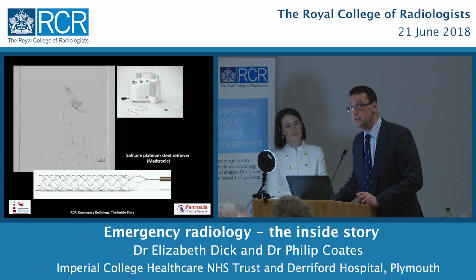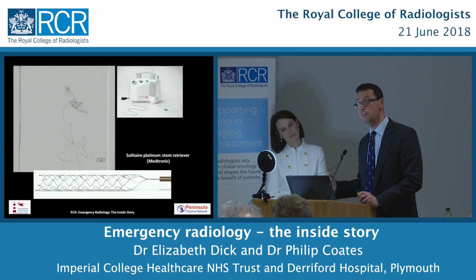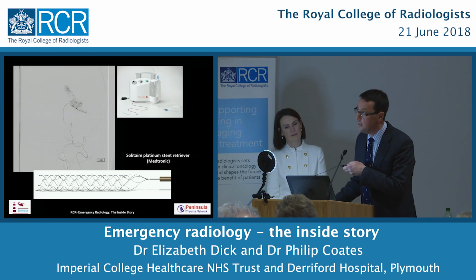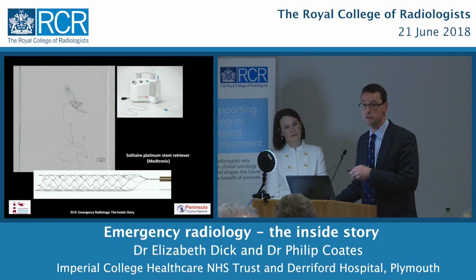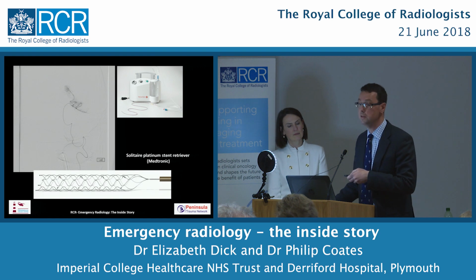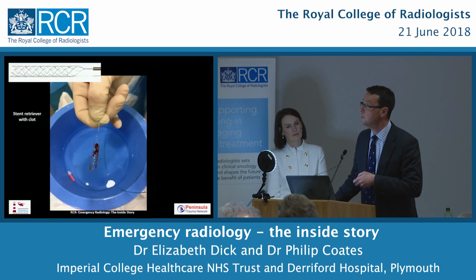So the approach here is a clot retrieval system. This is a Medtronic Solitaire Platinum stent retriever. And essentially, if you imagine the job here is one of a chimney sweep, we're retrieving clot on that stent. That isn't a stent that is going to line the vessel afterwards to hold it open. We're literally popping it up there like a chimney sweep to try and retrieve the clot and get it out so that those vessels are cleared of clot effectively. And that's what happened, that's what it looked like. You can see the clot entrapped on the stent retriever there.